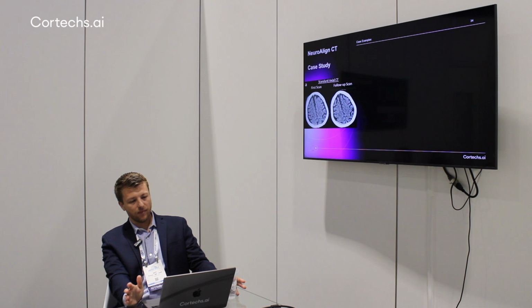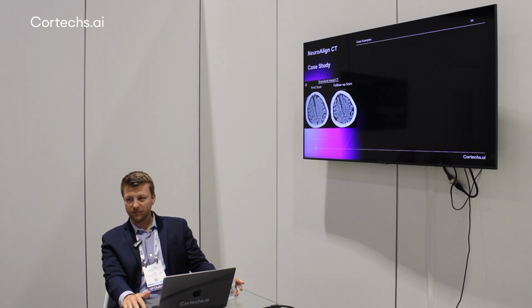Okay, so I'm going to get into more examples of some of the largest utility, which is, again, assessing change between 2 time points. This is the standard format. You have the first scan, second scan. This patient fell down, has a right frontal hematoma, and as you may be able to see here, there's a small little subdural. Pretty much every patient that comes in that has a bleed is going to get a follow-up study or multiple follow-up studies. At a busy trauma center and stroke center, that's going to be about 1/3 of what you're doing, reading follow-ups. And so the question, of course, is: is the subdural bigger? Is it smaller? Is there no change? That's what we're doing quite often.